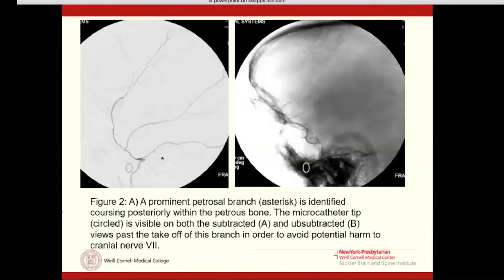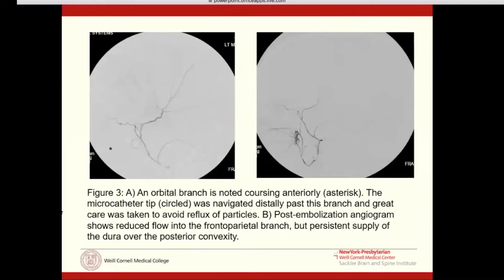It's very important to look for important anastomoses. Here's an example of a patient who had a very prominent petrosal branch. This artery is really important to be aware of, because if you embolize that, the patient will have a seventh nerve — a facial nerve — palsy on that side.